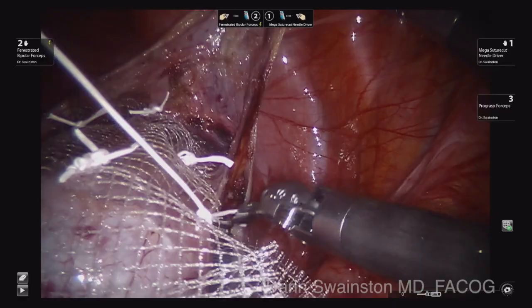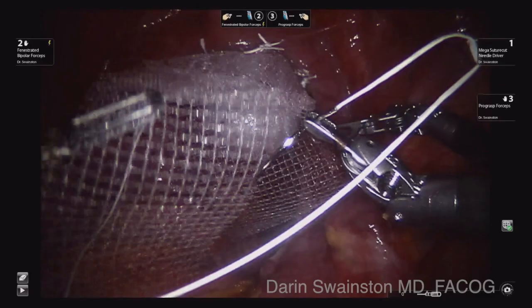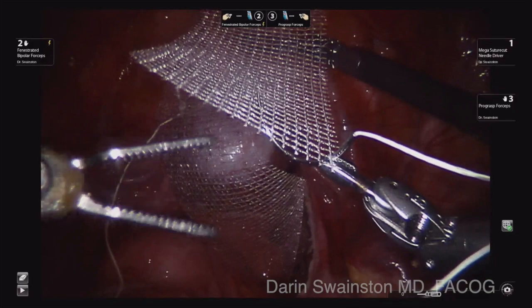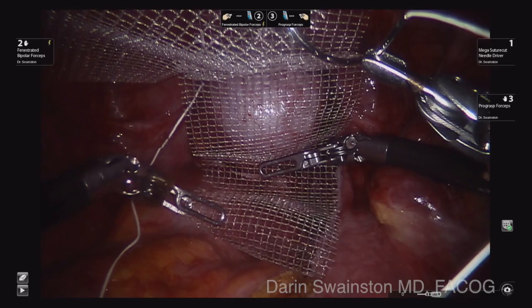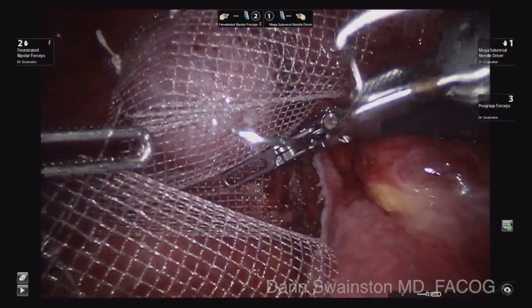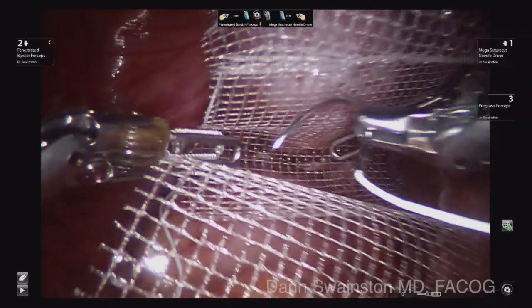This is the total number I use anteriorly — this is the highest I go on the vaginal mucosa. I do not put any over the top. See that gap there? It is at least several centimeters in size. Now I can lift that UPS vaginal manipulator up and see where I need to attach the posterior aspect. I had examined her earlier and seen that her rectocele was more significant than her cystocele, so there is going to be slightly more tension posterior than anterior. I am going to hold that in place with my right hand to make sure the tension is right, then use my left hand to position the mesh, and tack that in place. I do not want to go at the very top — I want to go down just a little bit away from the apex.